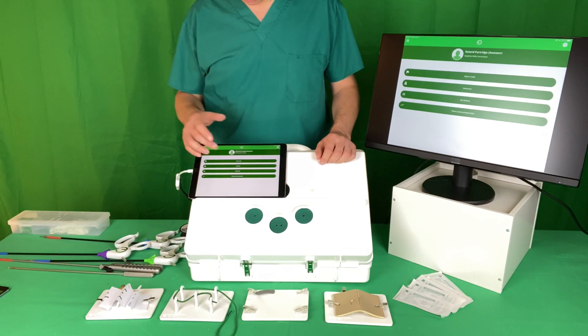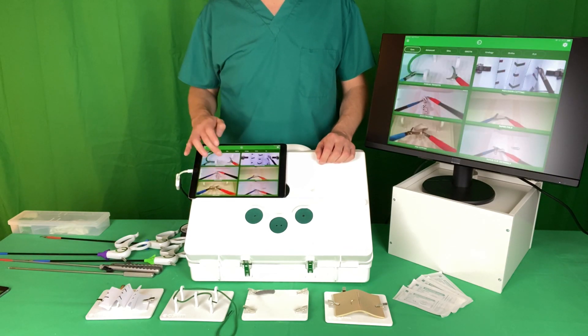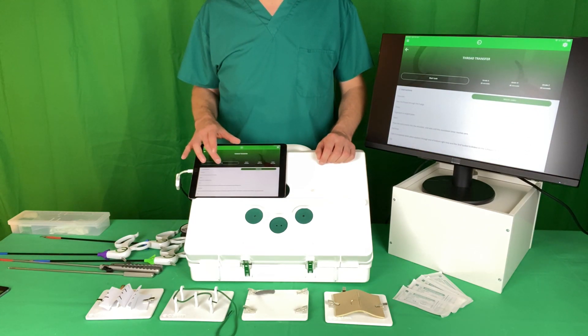So let's demonstrate it. You open the app, you click Start Task, you choose your module. When you open this up, you get some text to describe it and a video to watch to show you what to do.